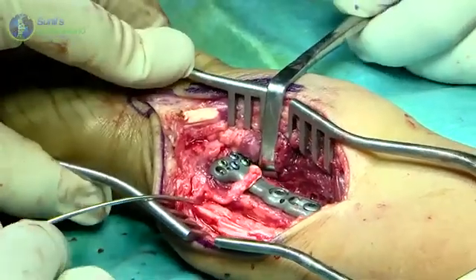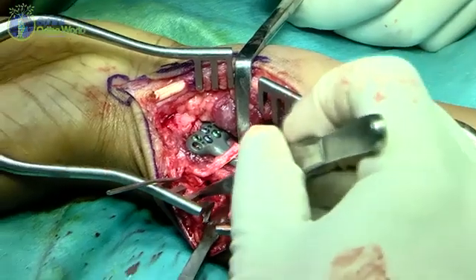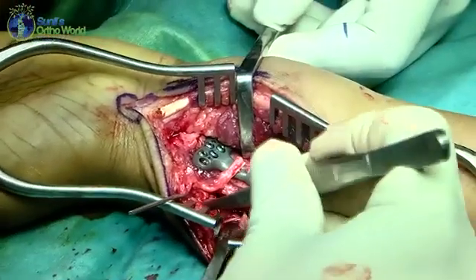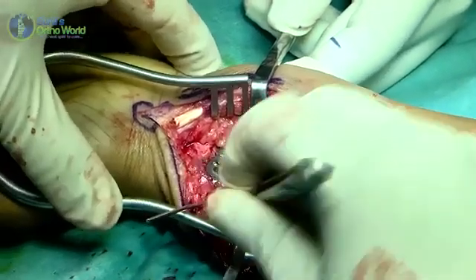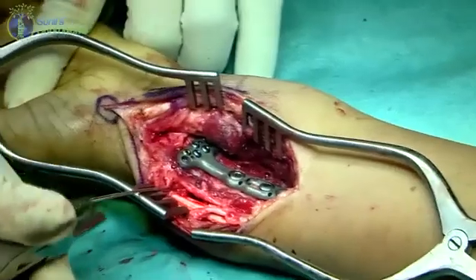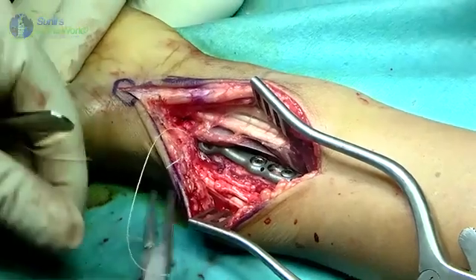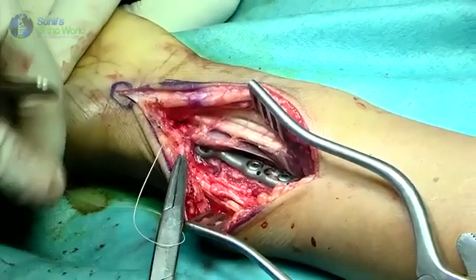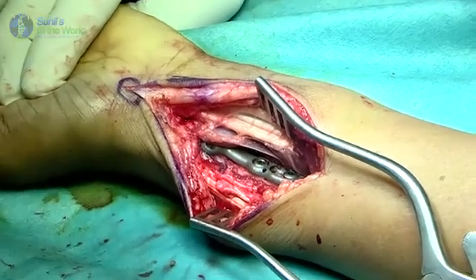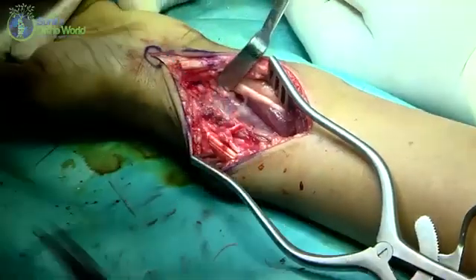The void created dorsally by the osteotomy can be addressed in a number of ways. Our preference is to use autogenous cancellous bone grafts harvested from the proximal ulna, though reports of using no bone grafts and also synthetic bone substitutes exist and remain very viable options. Once the defect is packed and the K-wire retractor is removed, the pronator quadratus muscle is repaired in an anatomical fashion. Proper repair of the quadratus muscle is important to prevent any impingement of the plate onto the flexor tendons.